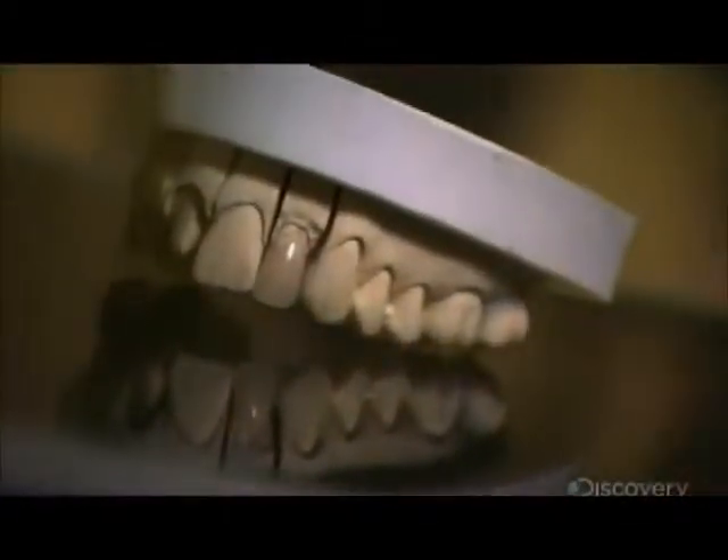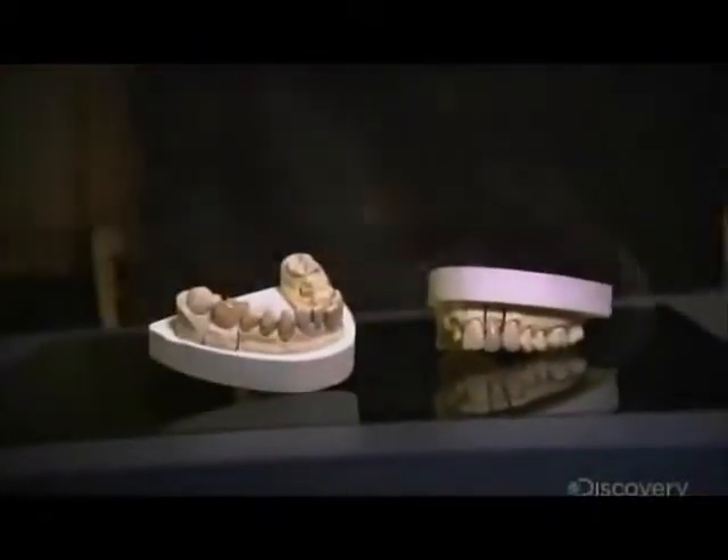Digital technology is revolutionizing dental treatment. 3D cameras and computers can now be used to produce crowns and other prosthetic restorations on-site, eliminating the need to send the work to an outside lab.